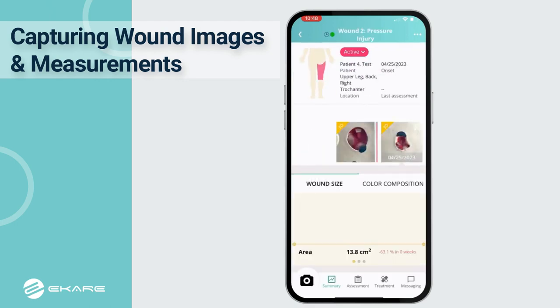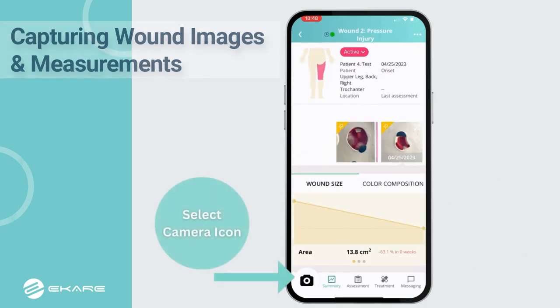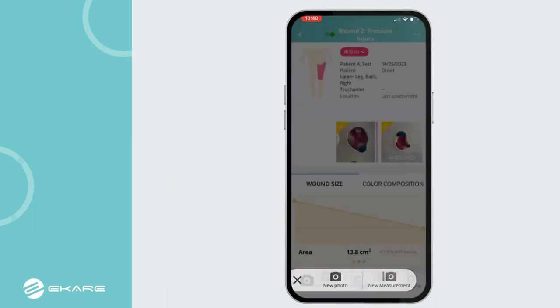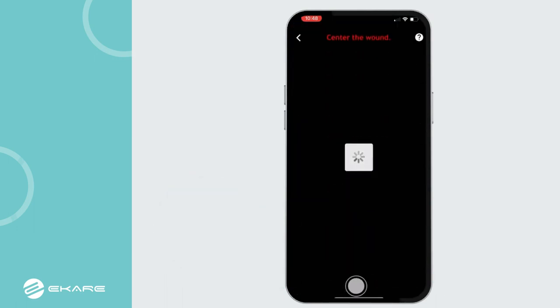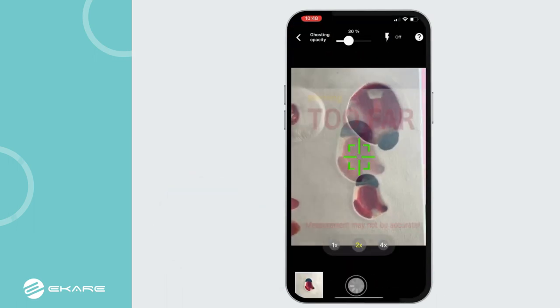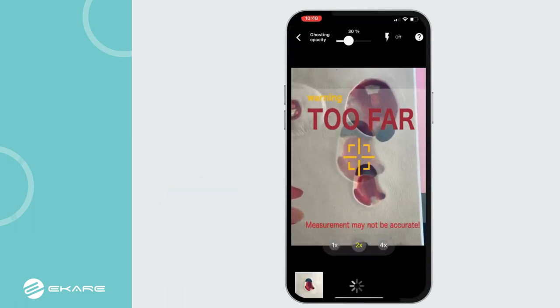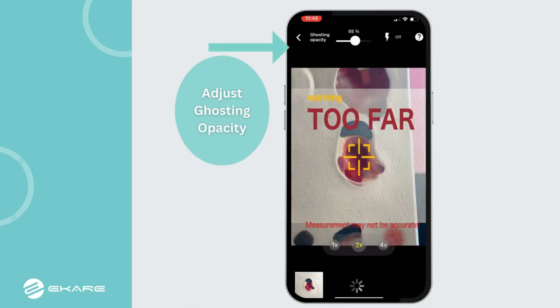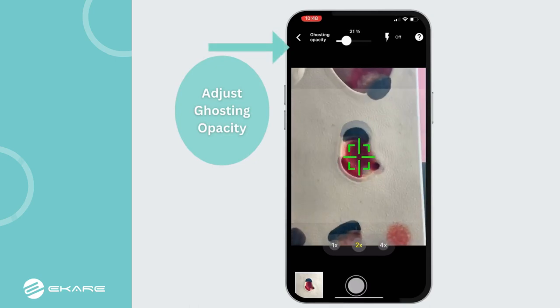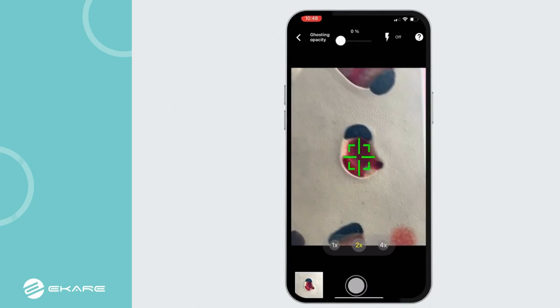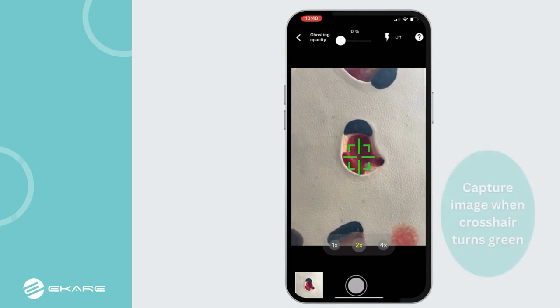To begin the wound measurement process, select the camera icon on the bottom left and select New Measurement to capture the wound image. The image guide will help the user capture a high-quality image. Ghosting opacity can be used to ensure image consistency with previously captured images.